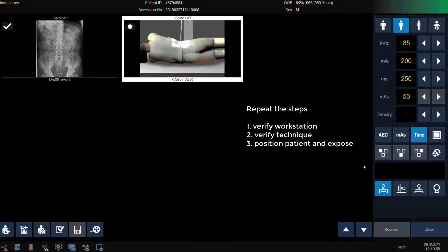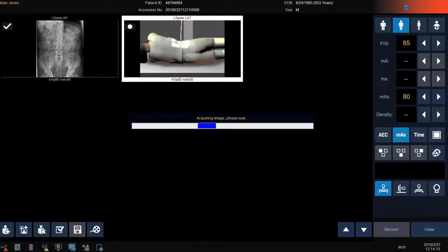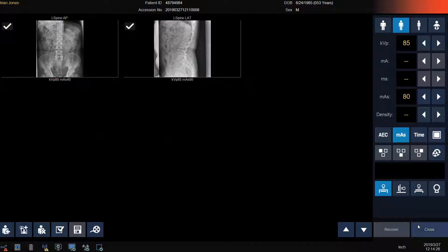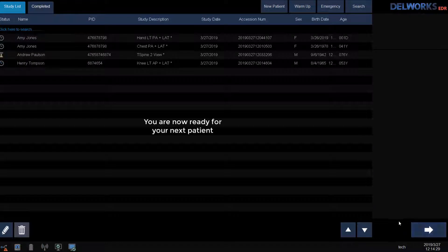Verify your workstation. Modify your technique if needed for patient size. Position your patient and make your exposure. If no additional views or changes to the images are needed, click the Close button to send the images to PACS. The study will be closed, images sent, and now we are ready for our next patient.